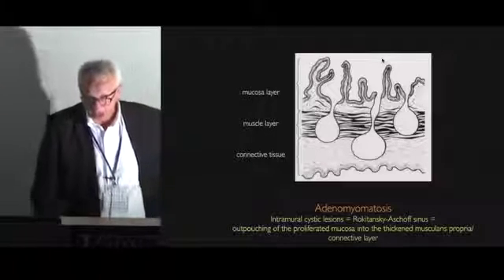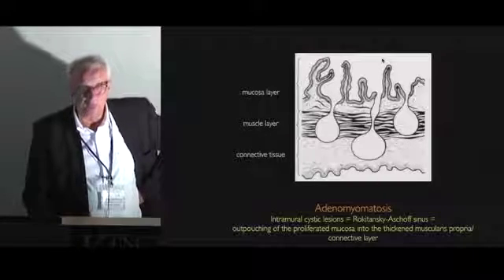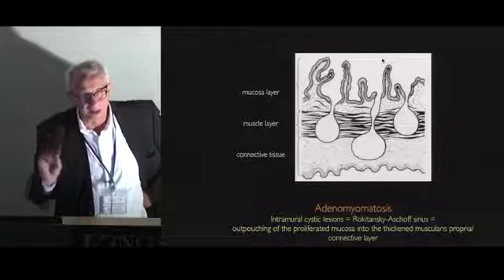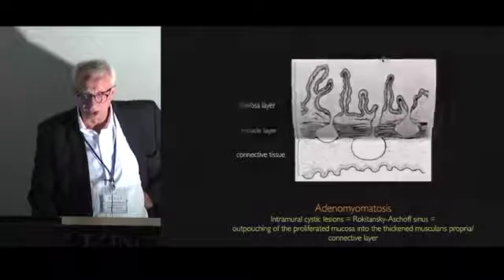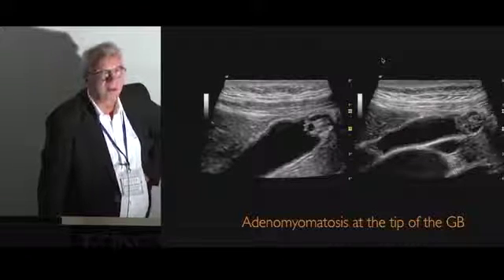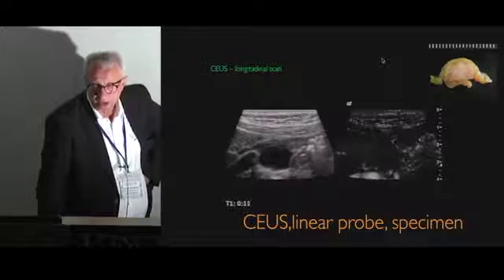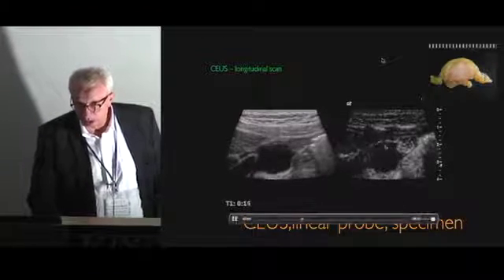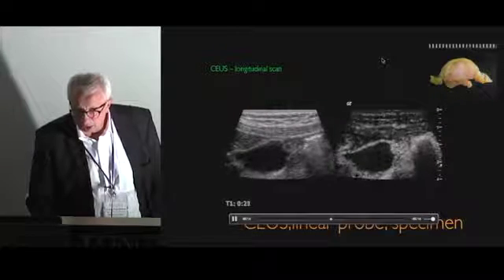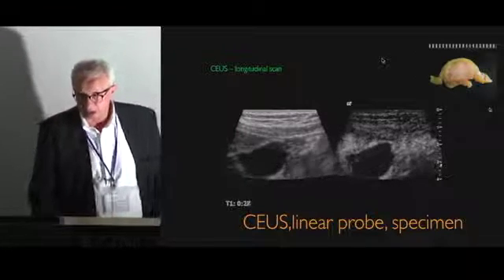Adenomyomatosis — you all know this. We have intramural cystic lesions, the Rokitansky-Aschoff sinuses, and we very often find calcifications or small stones in these cystic areas within the thickened gallbladder wall, making the diagnosis easy. This is adenomyomatosis at the tip of the gallbladder — a very typical finding. When we give contrast, we can confirm this is not a tumor invading the wall, and we can even see the Rokitansky-Aschoff sinuses a little better.